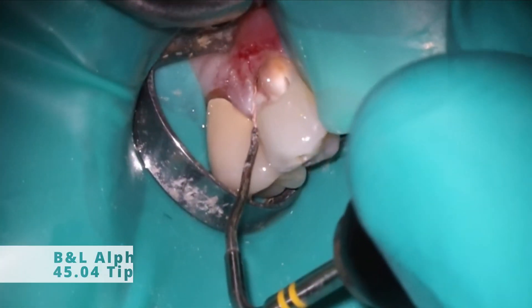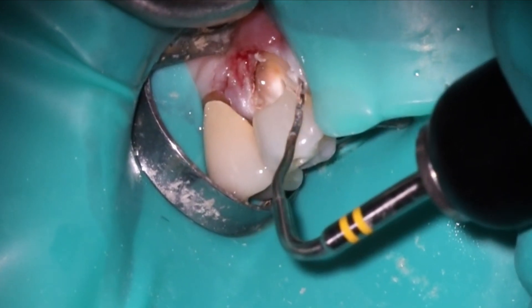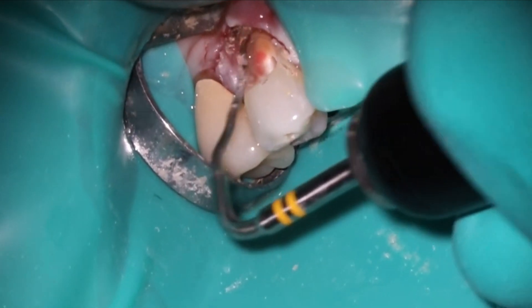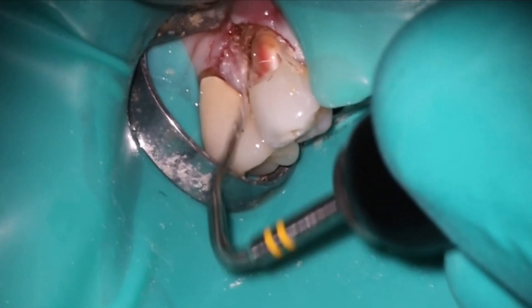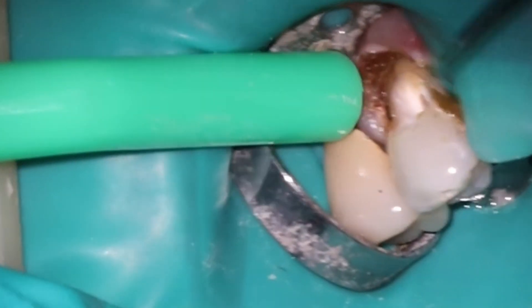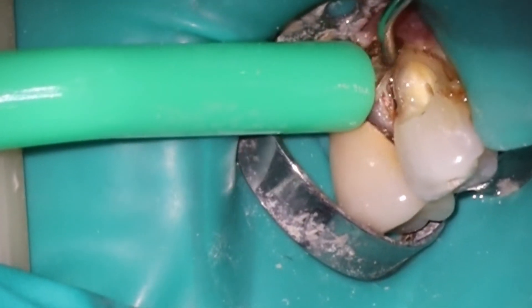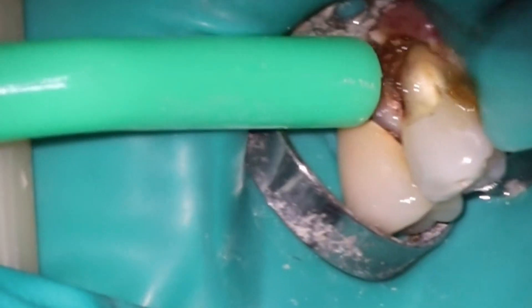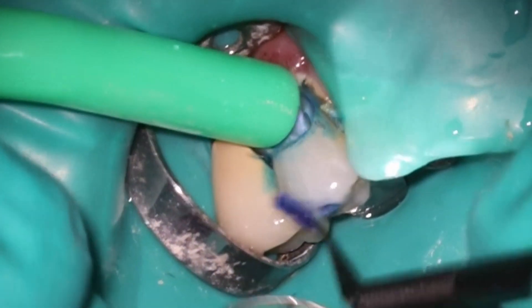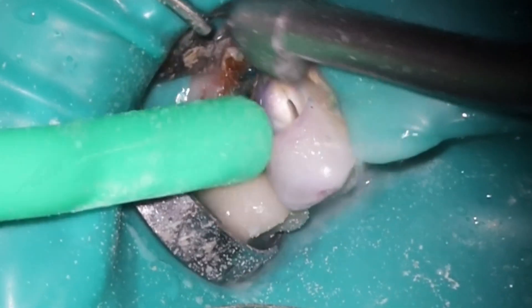We're going to do the restoration of the tooth now. I did drop down a little farther. When we took the check film to see where everything was, she had a really big coughing fit, the rubber dam went flying — so I had to completely change to a new rubber dam. I ended up dropping even farther down, so I'm on unattached gingiva right now, which I don't love. It will heal up — it's just not as resilient as attached gingiva. I was trying to push it back and cauterize it using the alpha tip. Using ferric sulfate here to help control bleeding as well, because Class 5s are notorious — if you cannot get good isolation they're going to fail. There are structural reasons for that: the dentin is kind of garbage in that area, and force concentrates inside there. I try to over-engineer whatever restoration I'm making, especially with Class 5s, because the failure rate is so much higher.